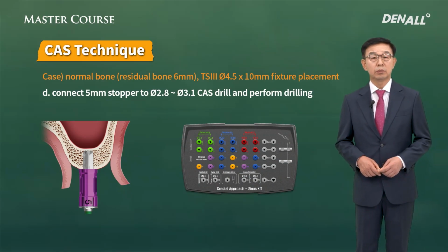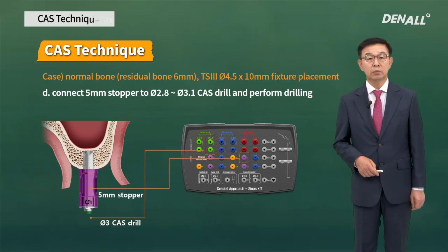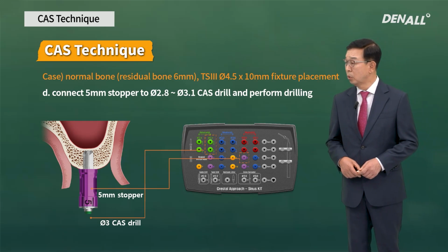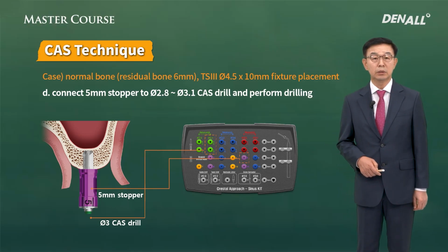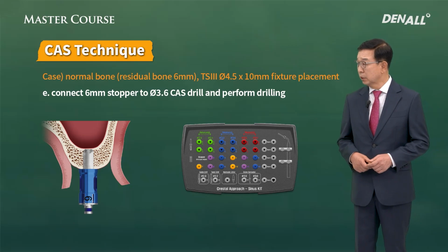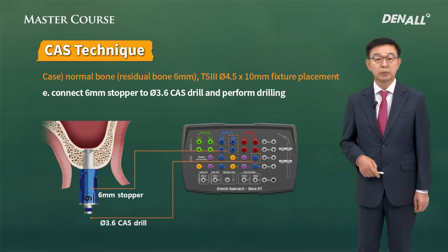Next, depending on the surgeon, in 2.8 or 3.1 CAS drill, 5 mm stopper is used and drilling is done. Depending on patient's bone density, it may vary. However, drilling is done slowly, about below 800 RPM. Width expansion is done at the same time, and 6 mm stopper is used in 3.6 CAS drill.